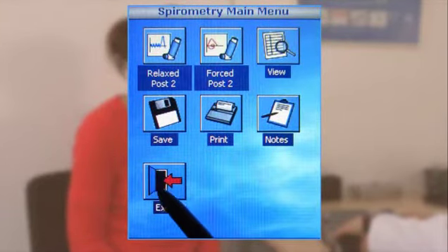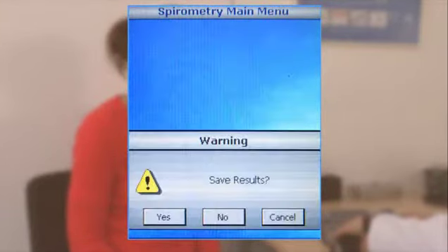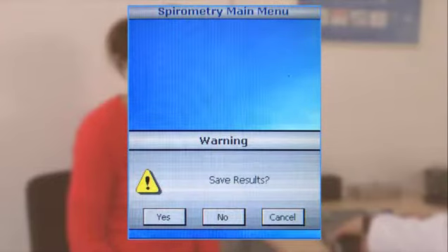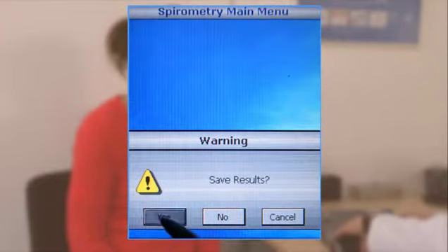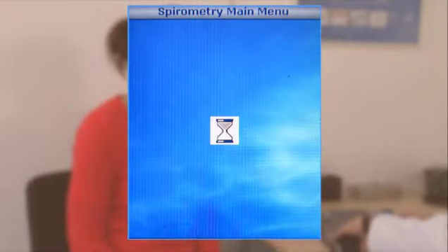Click Done when you've finished and don't forget to save the results of current tests before you exit.